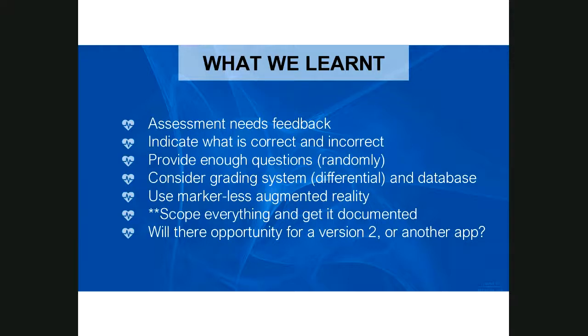And having only 20 questions that were fixed, I guess, constrains the usability of the app. That's something we're looking at in a future version in another app called Oculus Sim, where we've got a bigger question database with differential levels of difficulty.